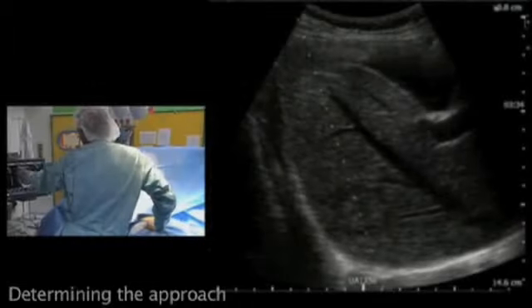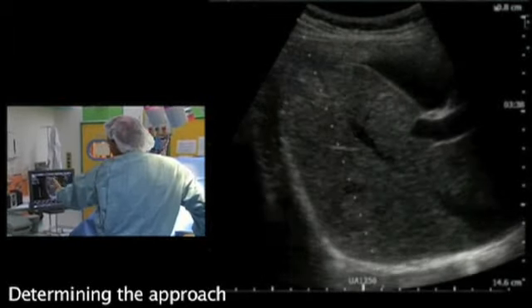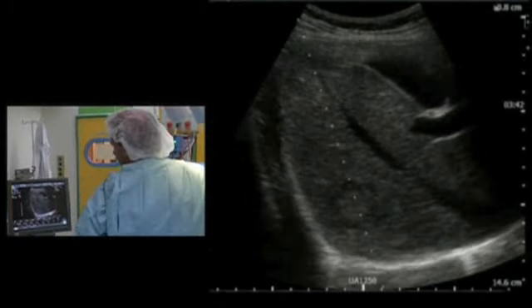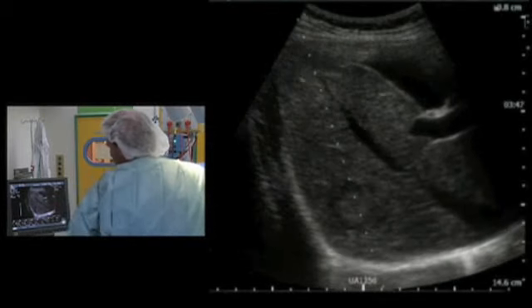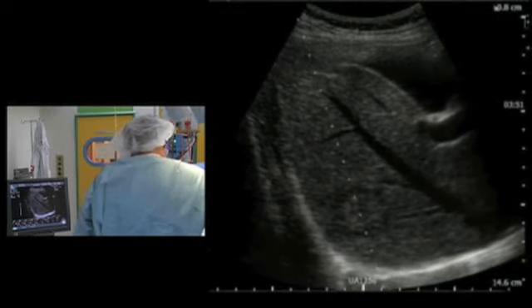Here we have the right hepatic vein, and by this rather long procedure we will have here, the access point is deep. Then on the other hand we will avoid a lot of structures and we have a very good vision about what we are doing. So I think I will select this approach.